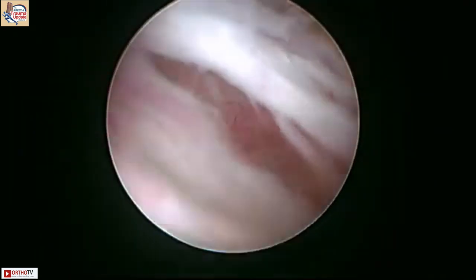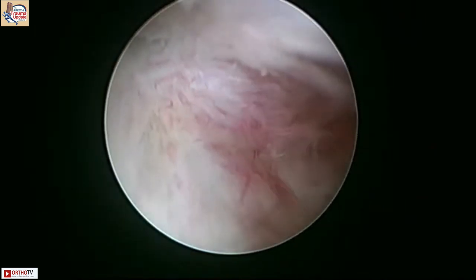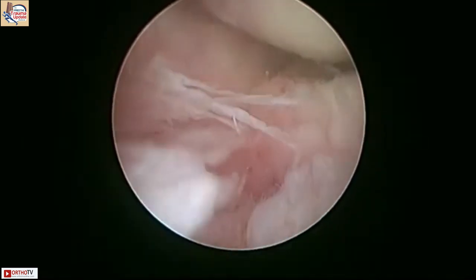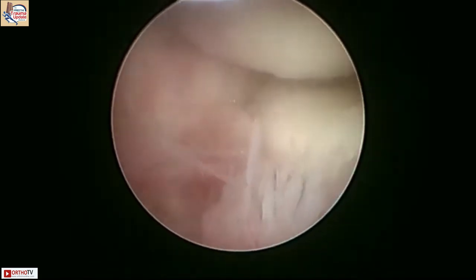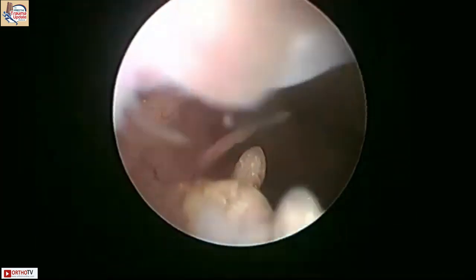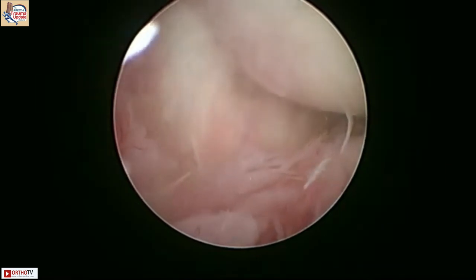So you have to find the capitellum, know where you are. I don't know how much deep I am in. Okay, so you can start seeing bone now, which means I am good. Now you can see the radial head and the capitulum. You see that? Perfect. And you can see the amount of synovitis he has. So now we are good to make a lateral portal. So lateral portals, you can make two or three, depending upon how you want to work.